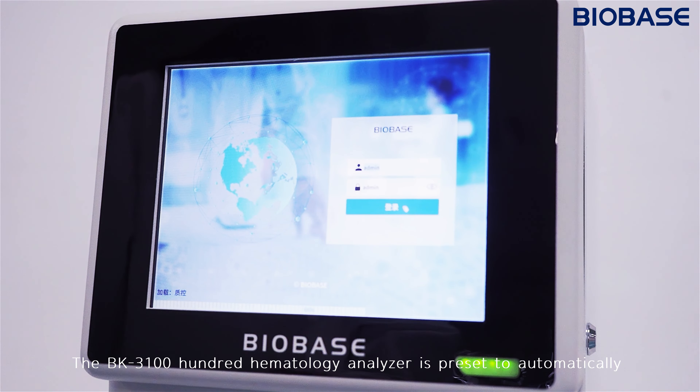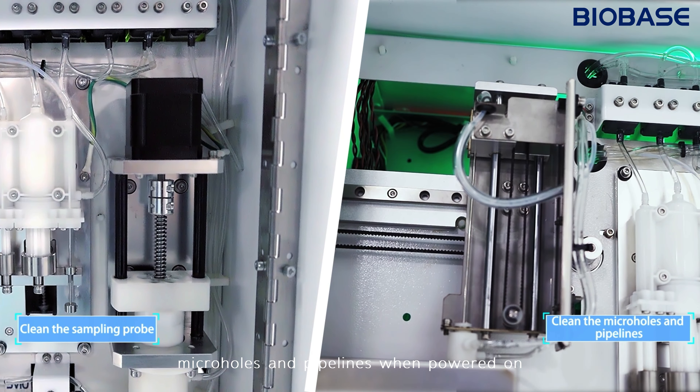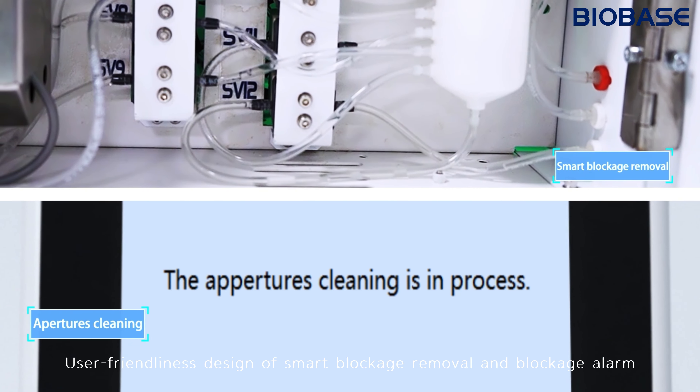The BK3100 Hematology Analyzer is set to automatically clean the sampling probe, micro holes, and pipelines when powered on. Its user-friendly design includes smart blockage removal and a blockage alarm.